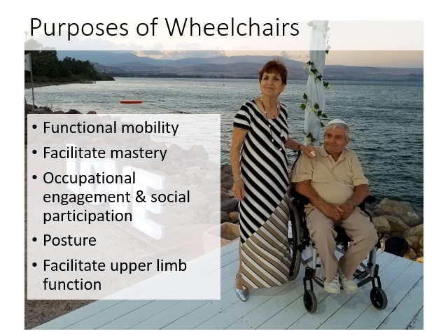Wheelchairs enable functional mobility with whatever means the person has available. They facilitate mastery of the environment. They, of course, enable engagement in occupations and also participation in social activities. Wheelchairs promote functional posture by providing appropriate back, trunk, and leg supports, and they facilitate upper limb function, which can occur, of course, with proper trunk support.